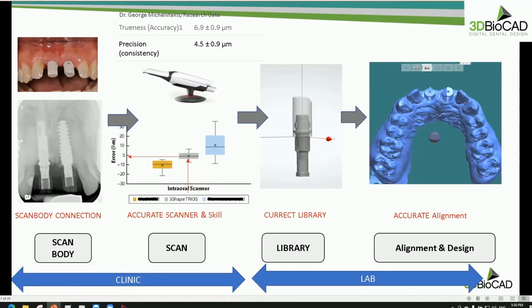And we can expect at least on the scan and CAD side, accurate work. Printing the model or milling, we can think about later too. But to me, I normally want to make three or four separate steps for finding a good way to make an accurate restoration: scan, CAD, and CAM, not just CAD and CAM, okay?